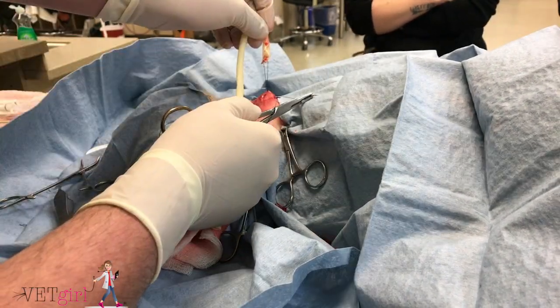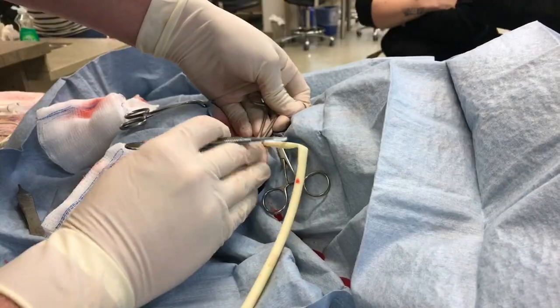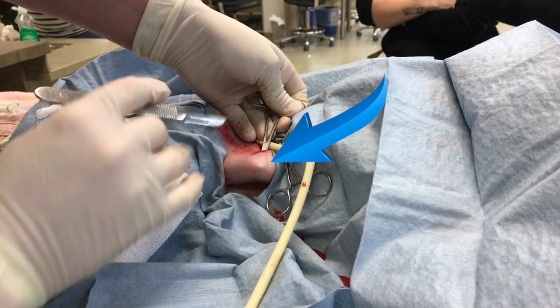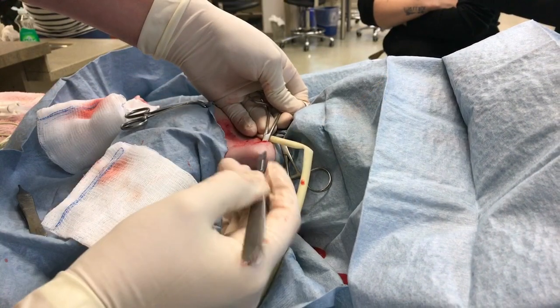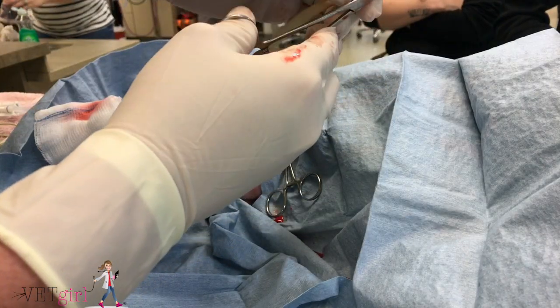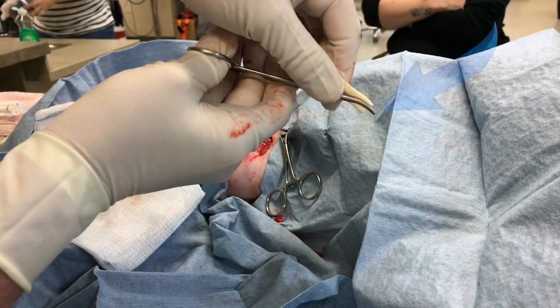Once the drain is tacked dorsally, the next step is to provide a suitable location to place the drain on the most ventral aspect of the patient to allow gravitational passive removal of fluid.